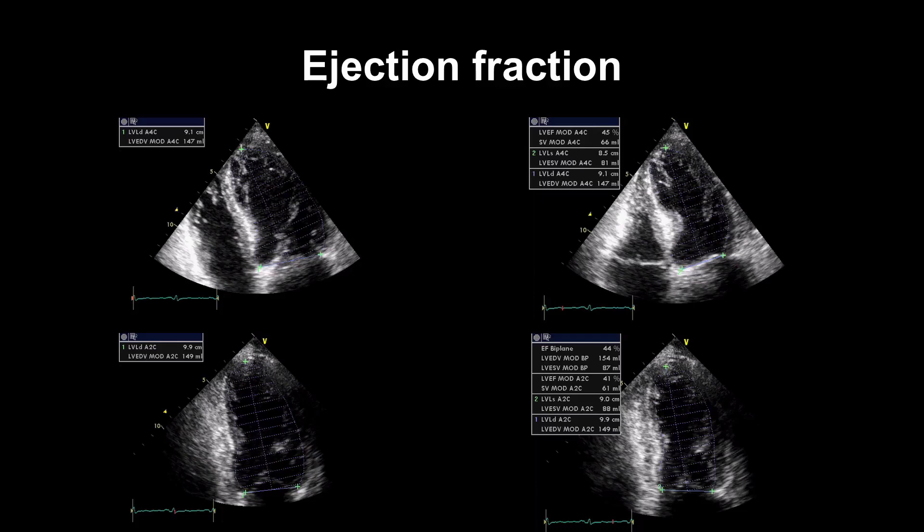So we can use Simpson's method, like we've got here, or we can use 3D. Or we may eyeball it and give an estimate. Ejection fraction is popular, but it's controversial. Not all departments use it, and those that do should quality assure their work against an independent standard.